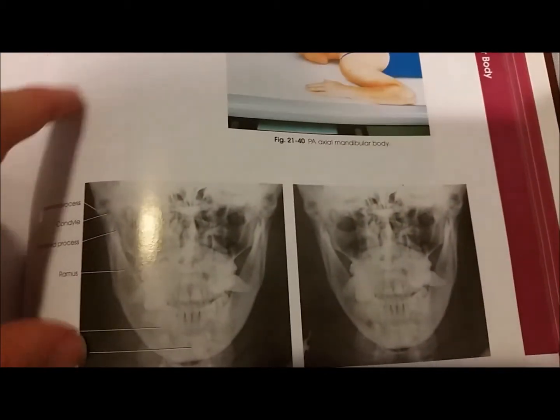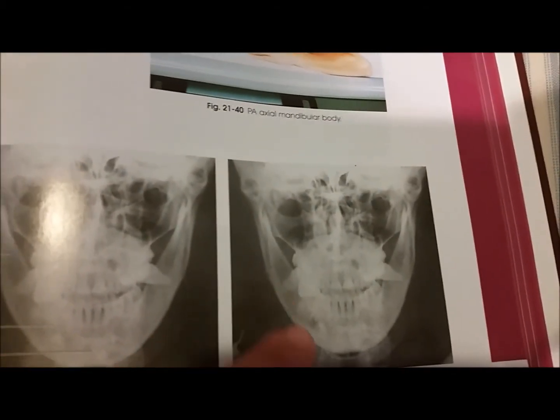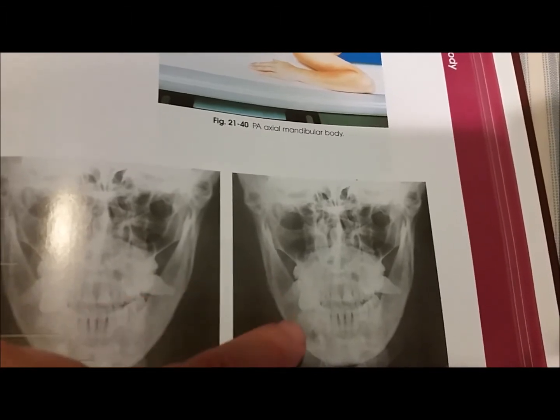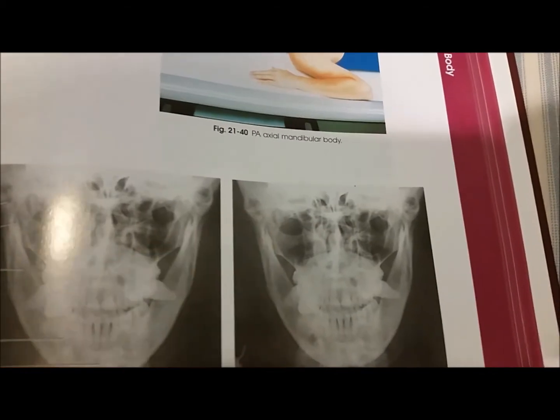Next we have our PA axial projection for the body. You can see the image right here. Now the body is a bit more elongated. The other structures are visible, but the body here is most clear and can be most easily seen, as well as the TMJs up top.